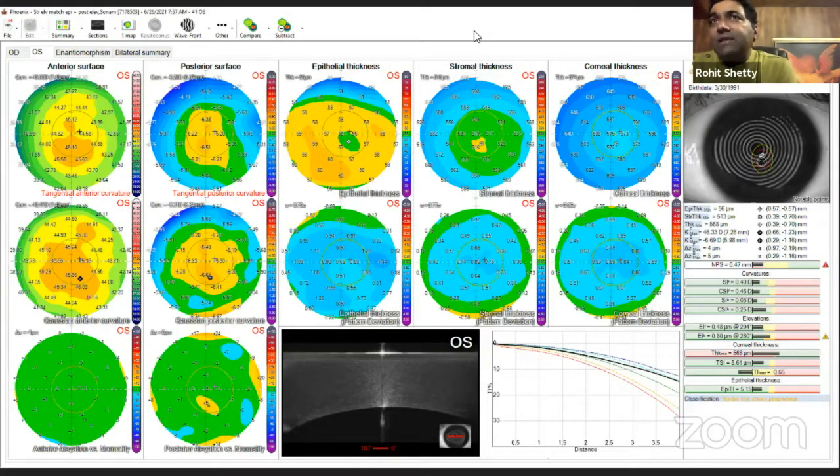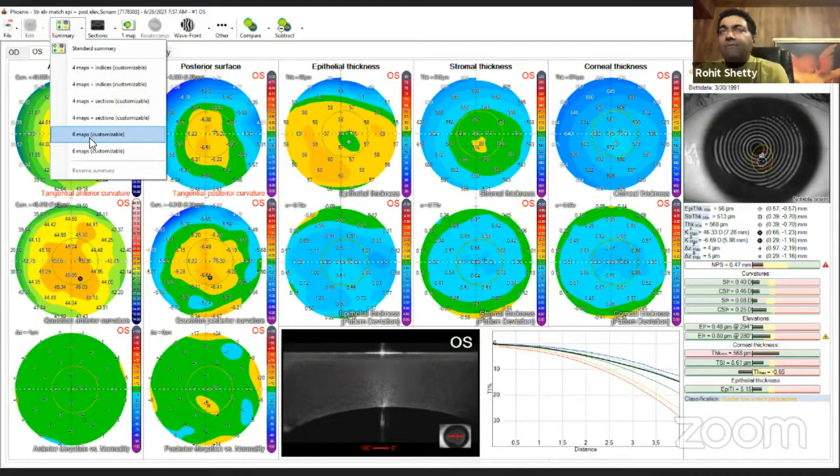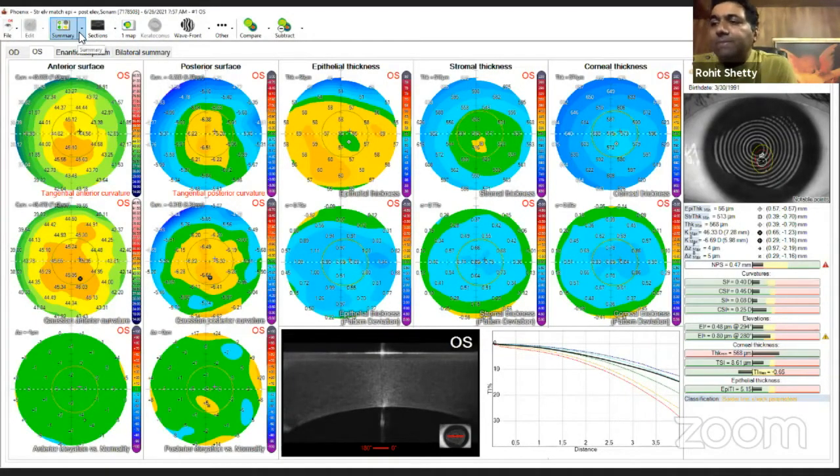So what I'm saying is, it's not going to burn a hole, even though CSO and my healthcare people are the ones who are going to benefit from this. Eventually, this is going to add more value to your practice. My practice has increased since the time I got the MS39. It's close to 3 years now. We were one of the first to buy it, and we had a different software. Now we use this beta testing software, and now the software is open for everybody. Do you agree to this, Dr. Vavekar and Divya? For me, it's increased the practice, not decreased at all.